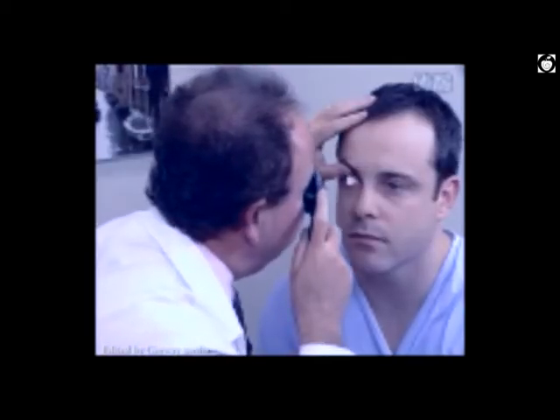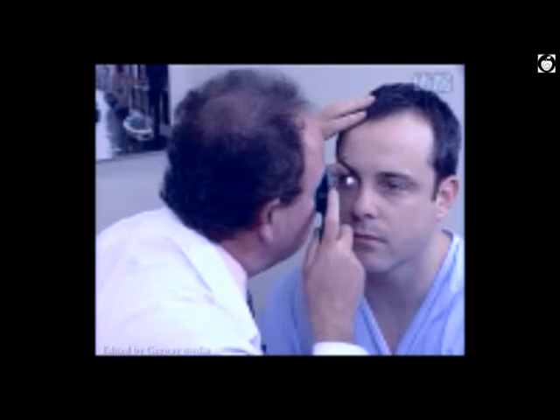The first thing that you'll notice is the red reflex. If a red reflex is not seen, one has to be concerned that there may be some opacity, such as a cataract, in the lens. As you move closer to the patient, you will turn the lenses to focus deeper as one gets into the eye, past the lens, through the vitreous, and then into the retina. You must always be at eye level with the patient.